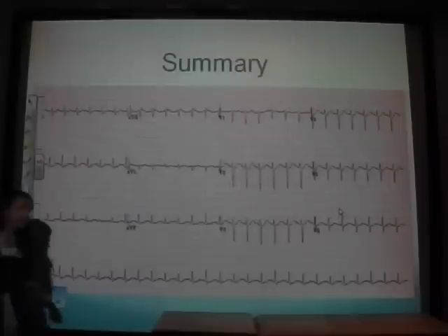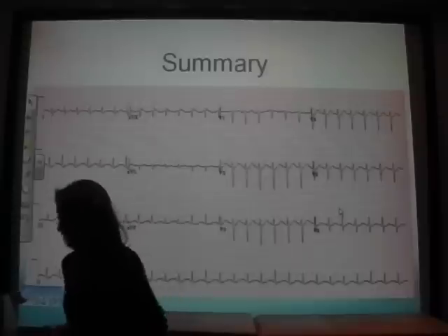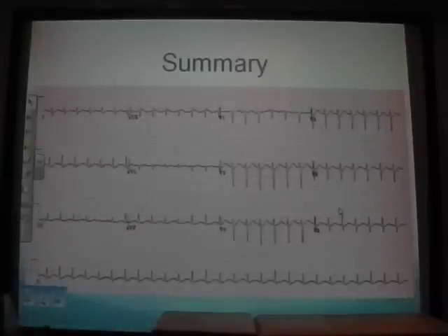You barely ever see the classical PE changes. I've only seen it once, and the person died about 20 minutes later. So sinus tachycardia, I think PE. Any other causes? Pain. Pain, yeah, brilliant. If they're in excruciating pain, she's screaming out for morphine, she's going to have sinus tachycardia.